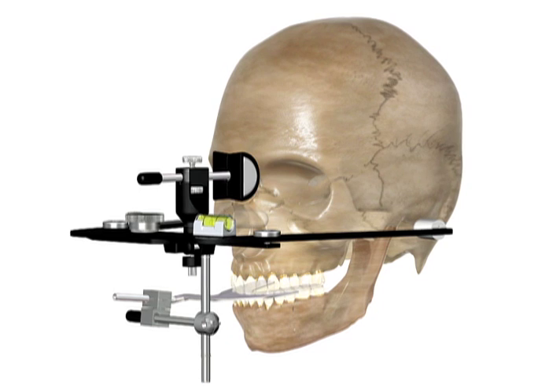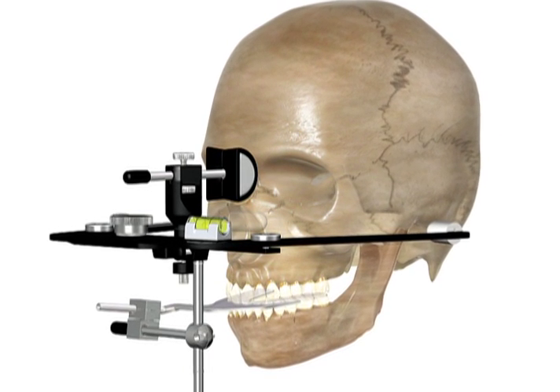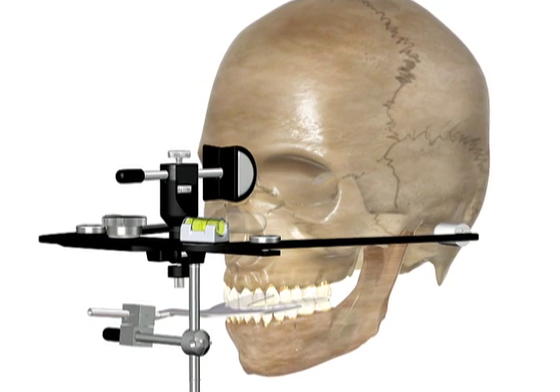The face bow is an easy tool that aids the diagnostic process and makes treatment more predictable. Even though it is viewed as a dreadfully complicated tool by some, it is easy to master and takes all of two minutes to record. Dental assistants can be easily trained to take this record.